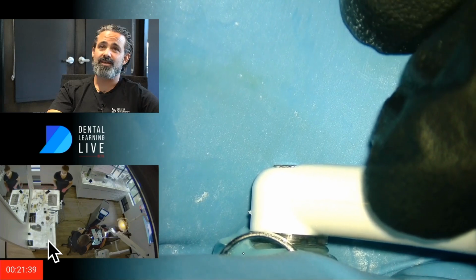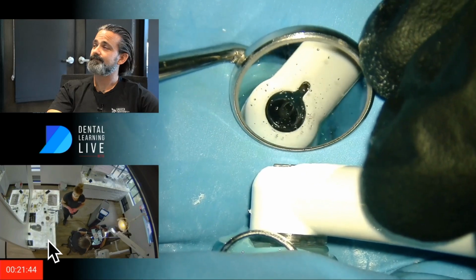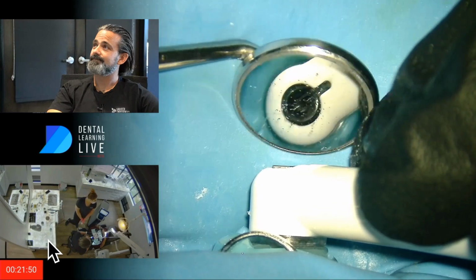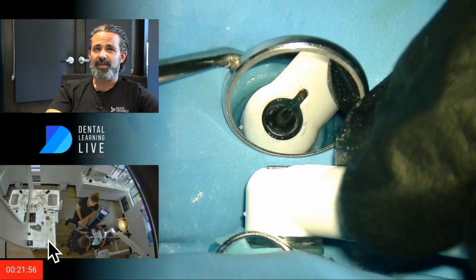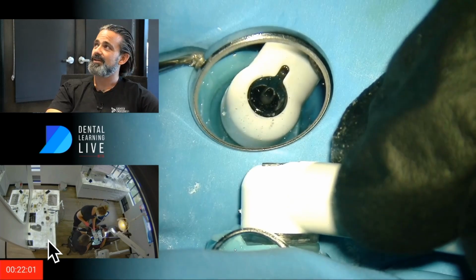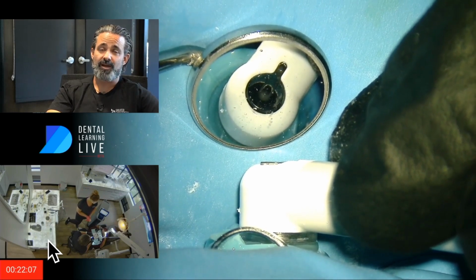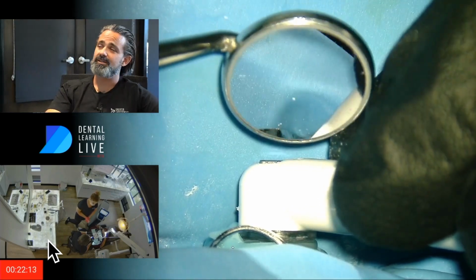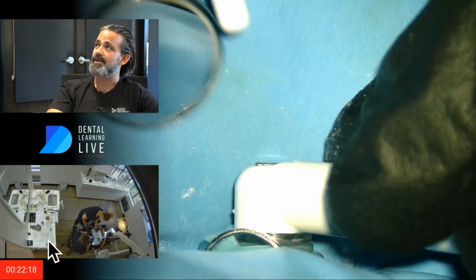All right, we're coming to the end here, I promise you. Time to wipe the mirror again. But you know what? This sort of boring scenario that we're watching is actually good. You don't want events during this. You want it to just be predictable. And I find the way to make it predictable has to do with how you build the platform, which is why I wanted to show you the Stovetop here and just a nice way to inject. Obviously, I wasn't perfect because I had to do some patches, but big deal. Adds a minute.